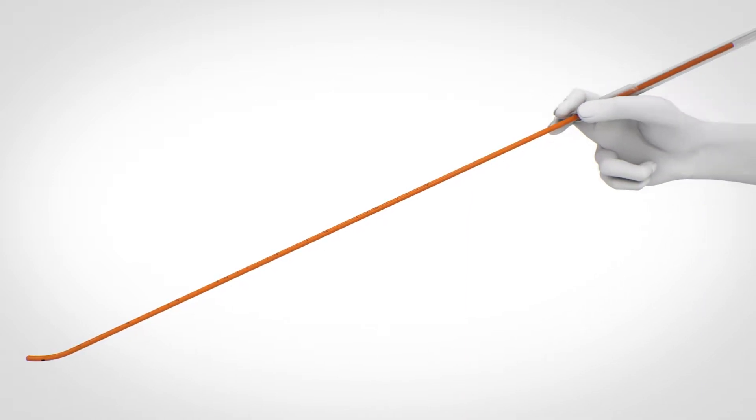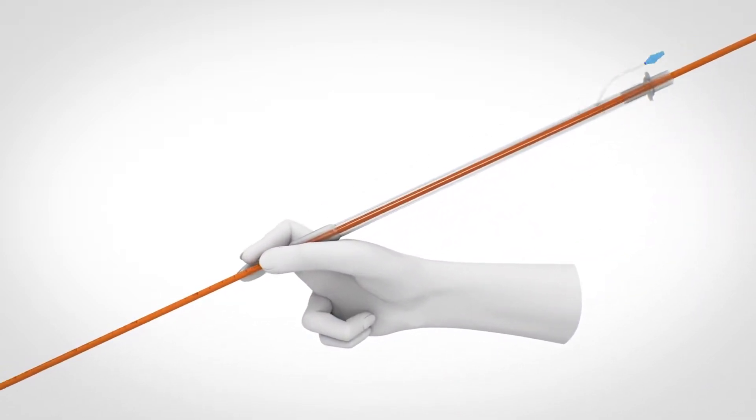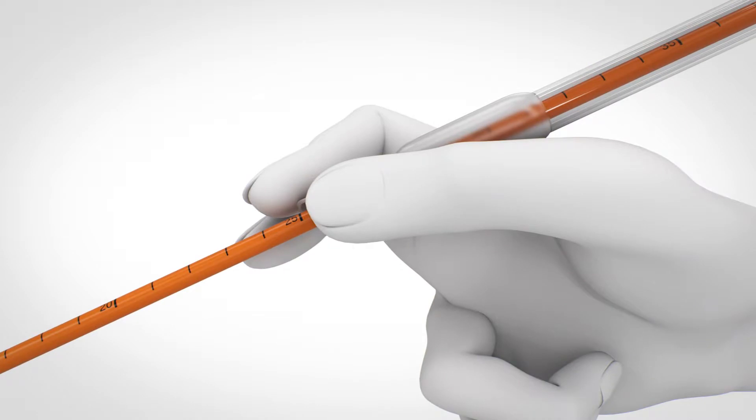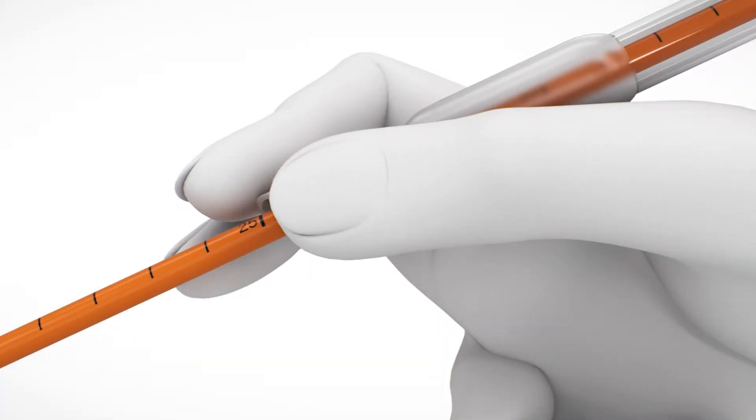Preload the tracheal tube over the EyeBougie and hold the EyeBougie together with the tip of the tube at the 25-centimeter marking.